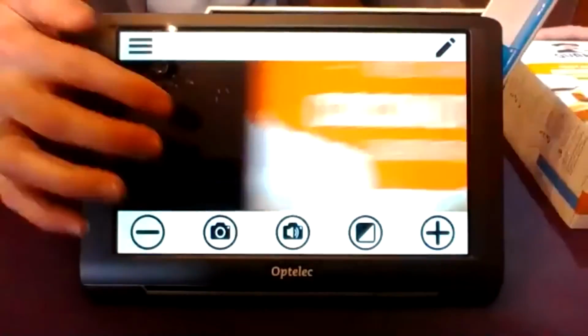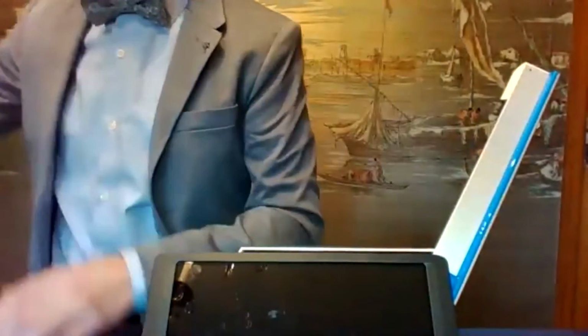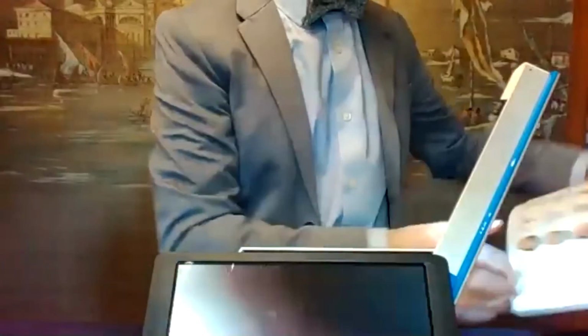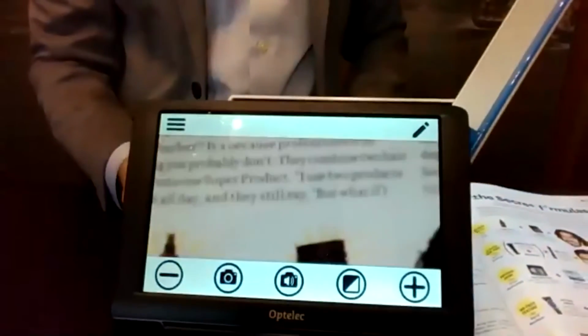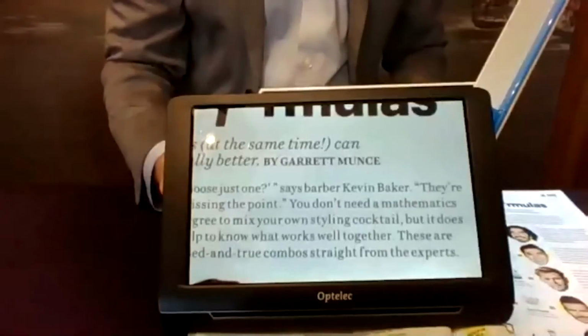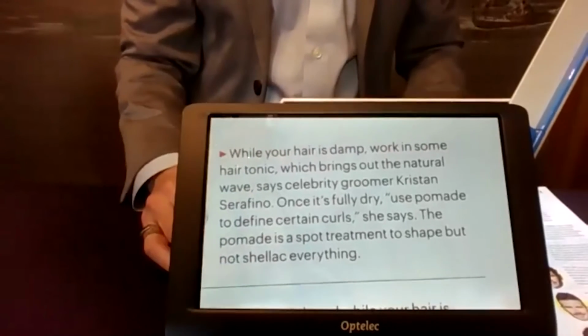I really like that example, because that's quite a thick box, I believe. I mean, it's a good couple of inches. What I found with some other devices in the past is that the fixed depth can be tricky, and there's often not a lot of tolerance in the performance of the camera. We've taken the time to ensure that if you put a box under there that would significantly change the focus depth of what the unit is trying to read, this will still perform. It has enough tolerance that even if you put something very thick under there, it would do the adjustment and still provide a very nice, crisp image of the text that you're trying to get hold of.